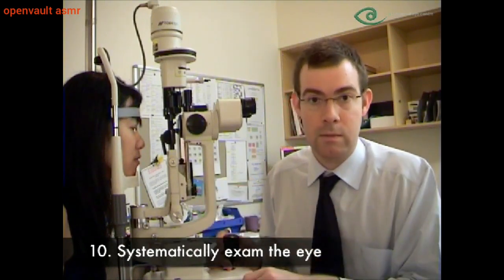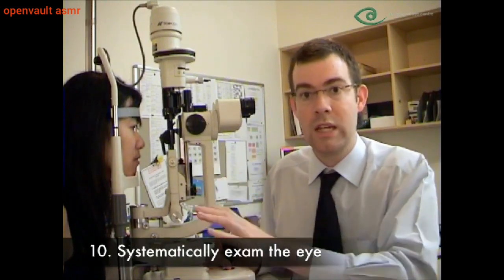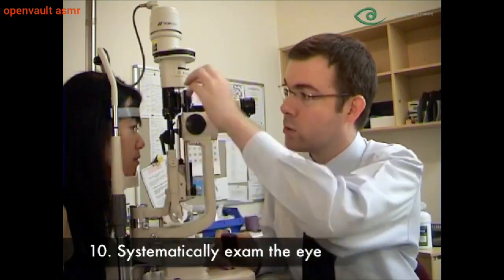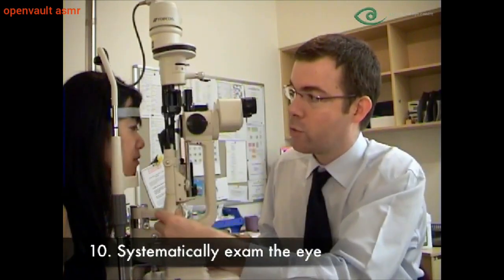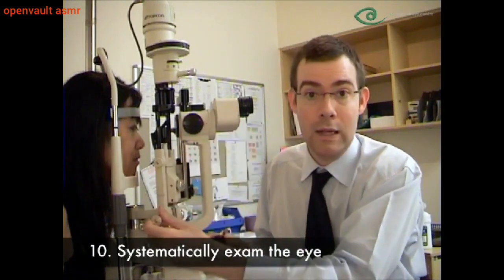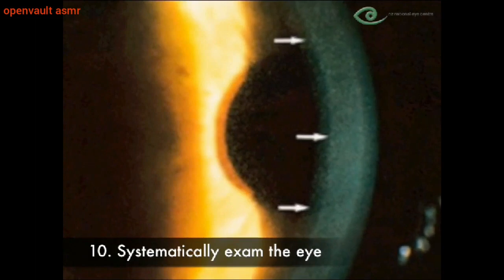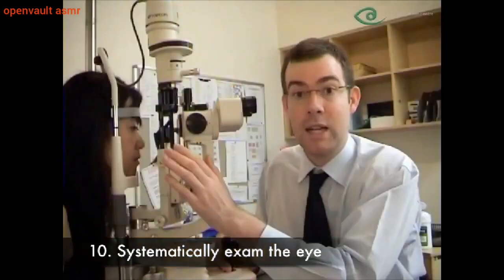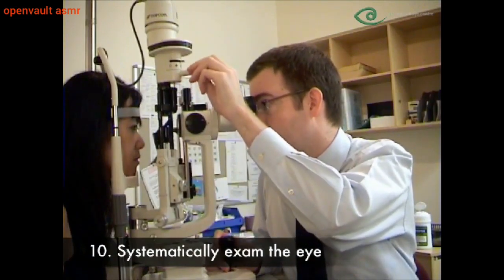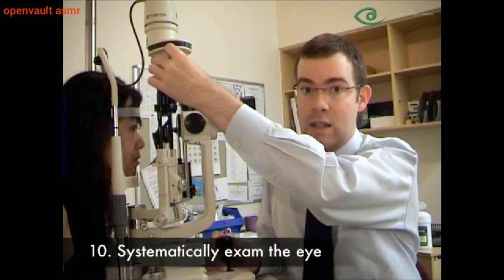and anterior vitreous. To examine the cornea, initially use direct illumination to identify areas of opacity or other lesions, but then make a tall, thin beam angled at 45 degrees coming from the side of the patient's ear to avoid inadvertently hitting their nose, and this gives you an optical cross-section through the cornea and enables you to judge the depth of lesions.